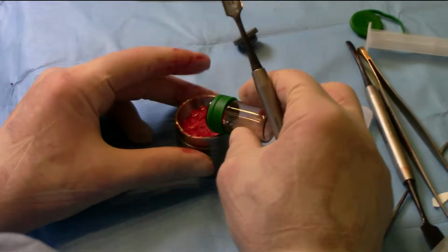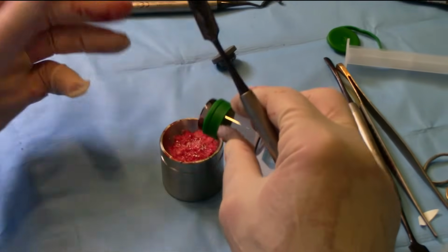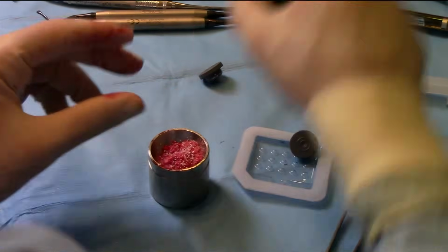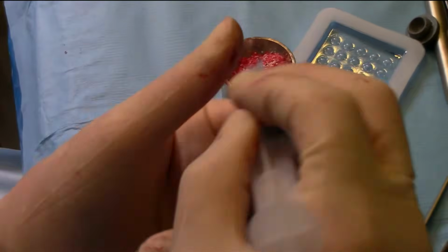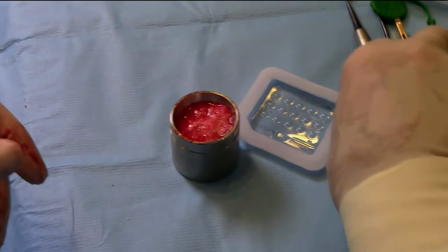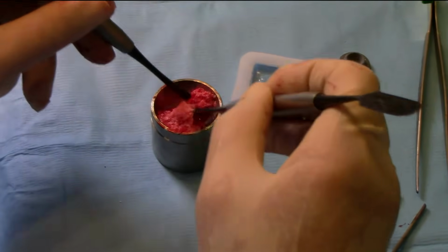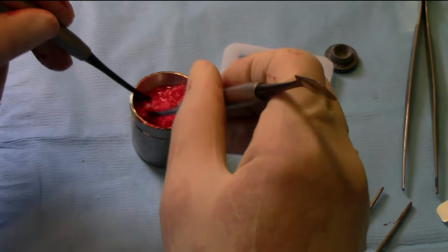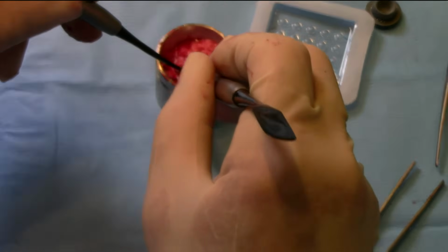So this half gram, I'm just going to use. That's good. We have a little bit extra left. I have a feeling this is going to be enough.